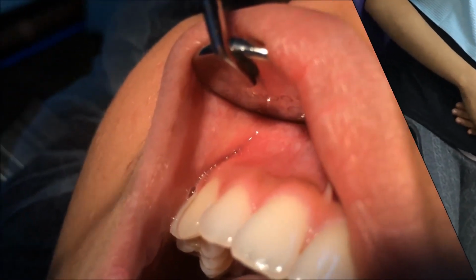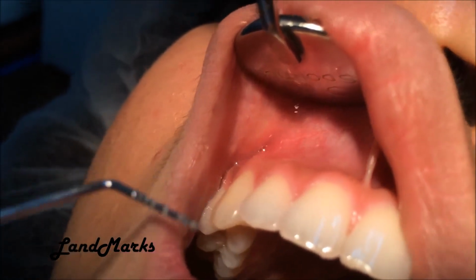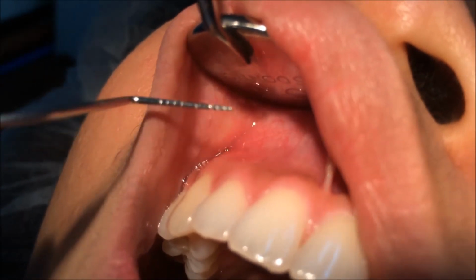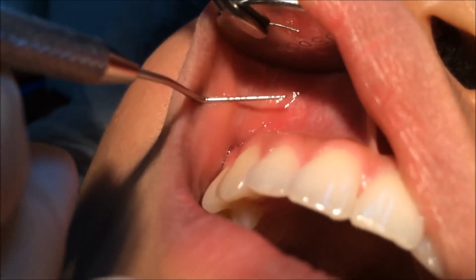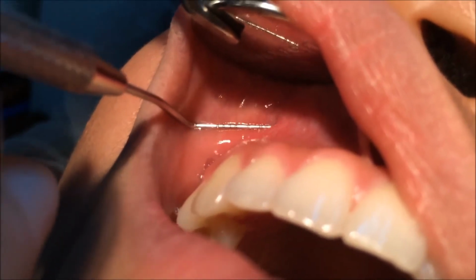We'll be showing you the area of insertion, the target area, and the landmarks of the superperiosteal technique. First, the area of insertion is the height of the mucobuccal fold above the apex of the tooth. Here we showed that this is the height, and this would be the area of insertion of the needle.